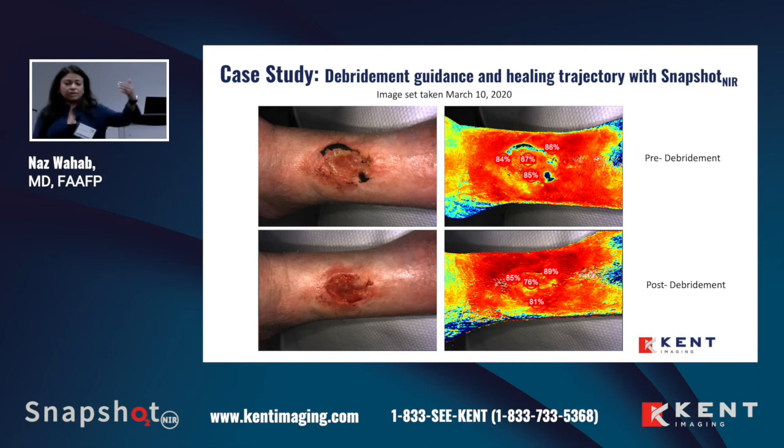Yes, you can get a snapshot. Yes, you can get an idea and an average on the one time, but really where the magic happens is when you're taking serial images over time. Serial images from your interventions, whether they be topical, whether they be surgical, it doesn't matter, but that over time.